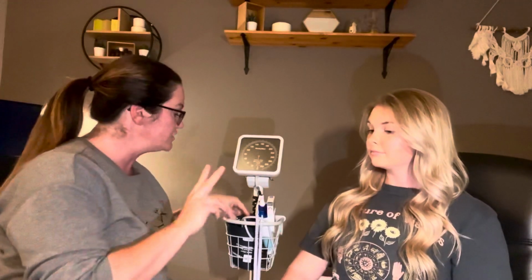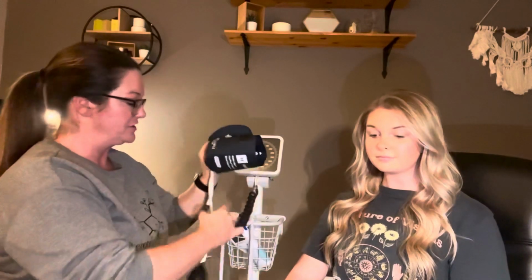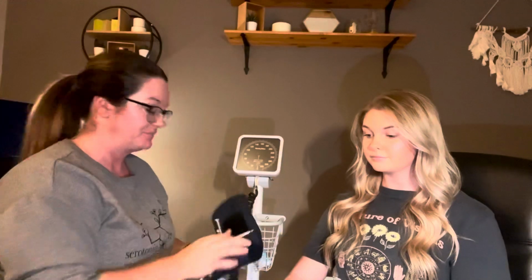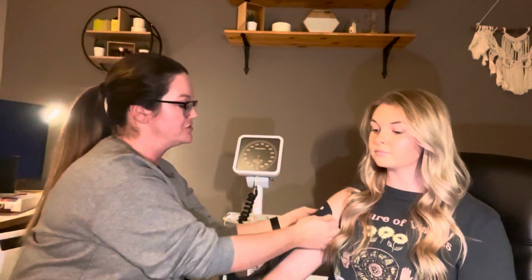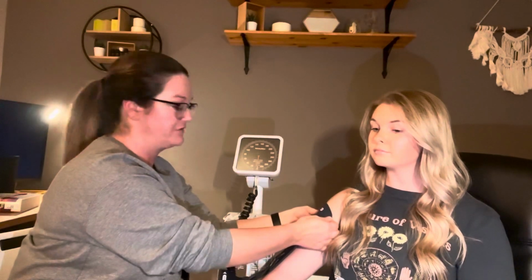The next thing I'm gonna do is obtain a blood pressure. So I'm gonna do a 2-step blood pressure reading. And when doing a 2-step blood pressure reading, what we're doing is we are obtaining a baseline, okay? So the first thing I wanna do is get my cuff out, make sure it fits my client correctly. So I'm gonna pull the sleeve up. I'm gonna take the end of the bladder and measure it around the arm. So this should be no more than 40% the circumference of the arm.